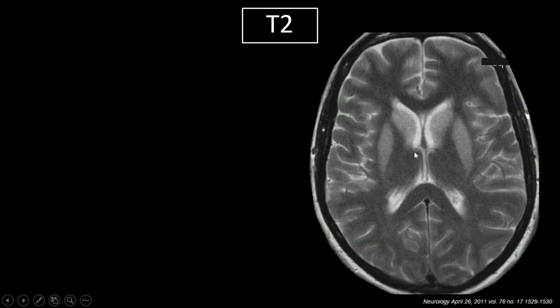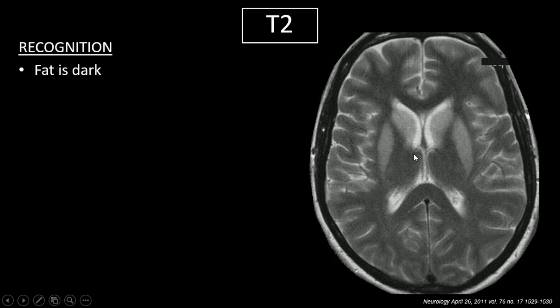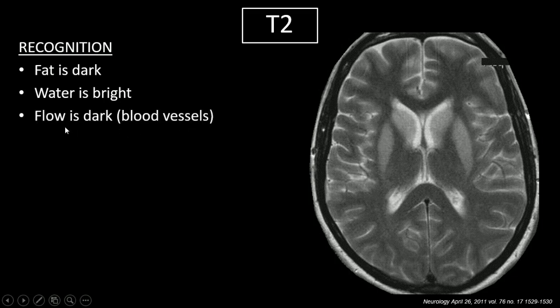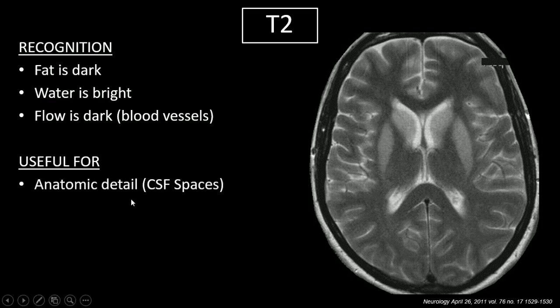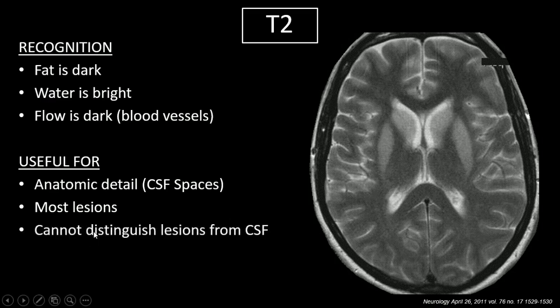Let's pull up our T2 image. How do we recognize it? Everything is flipped. Fat is dark — these highly myelinated areas, which are fat, are dark. Water is bright, so look at our CSF right here in the ventricles — it's pretty bright. But flow is dark, and this is called flow void. Where there's fluid moving at a high velocity, like a blood vessel, it's going to be dark. T2 is useful for anatomic details and picking up most lesions in general, though it can trip up when lesions or edema are close to CSF spaces because they'll both be bright.